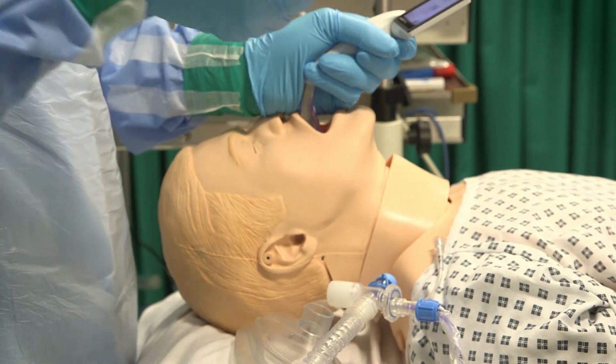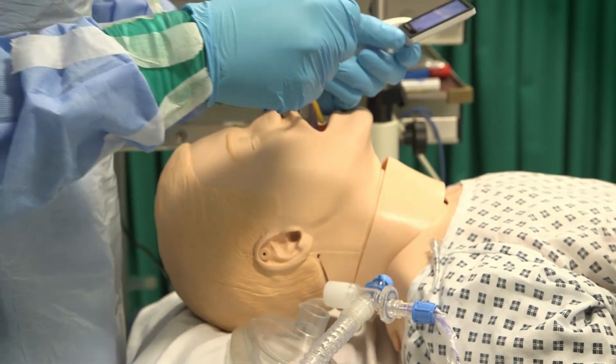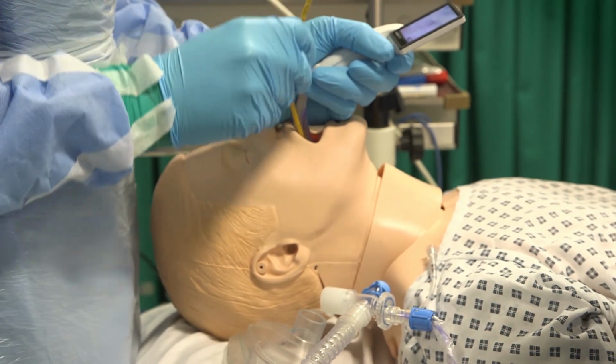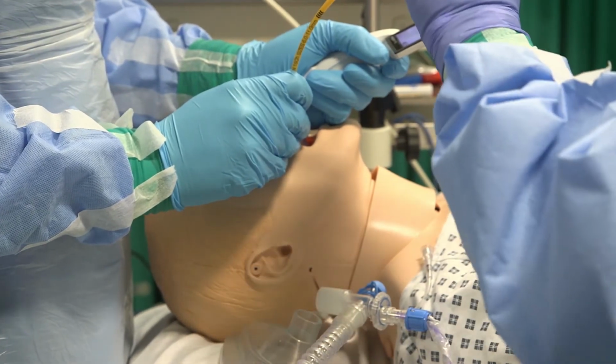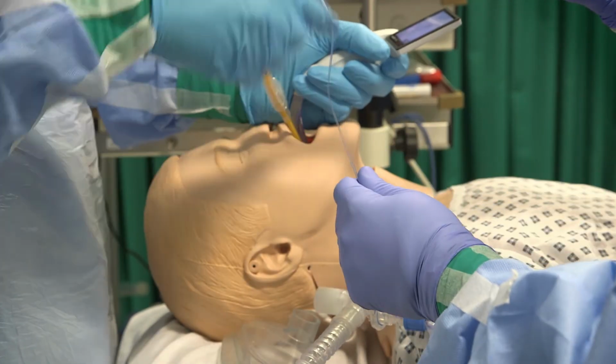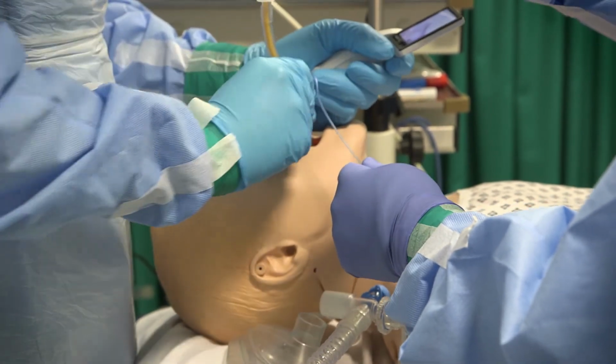Okay, so if I could have the video laryngoscope, please. Okay, and the bougie, please. Thank you. So, an ET tube. Okay, have you got the bougie? Yep. Okay, tube in, so bougie out, please.